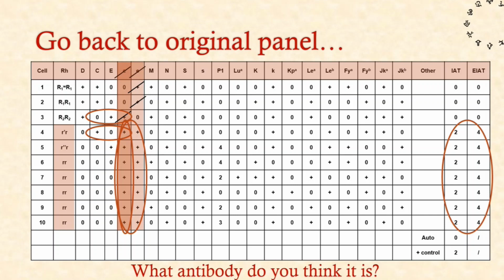So what antibody do you think it is? Do you think it's anti-little c? Do you think it's anti-little e? Do you think it's anti-F, which is anti-little c, little e, in combination? Or you've lost me, haven't got a clue. Feel free to put those in.